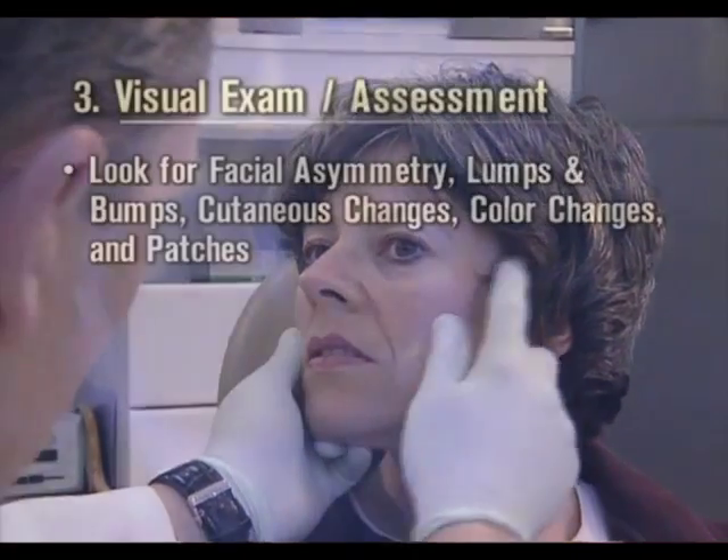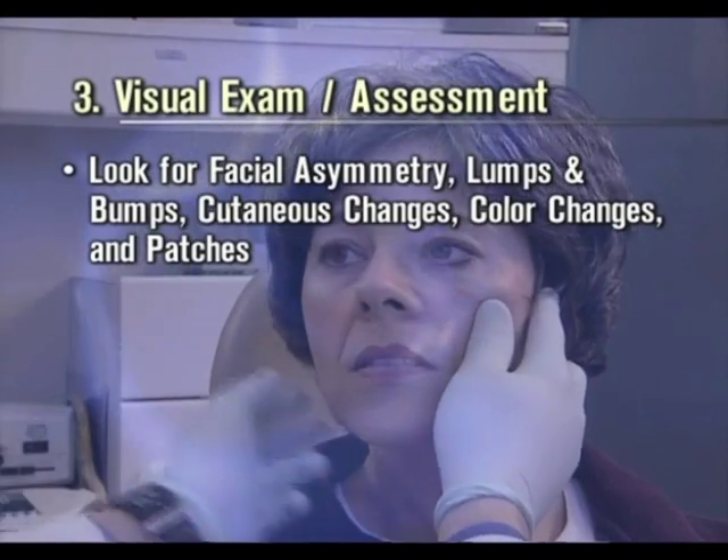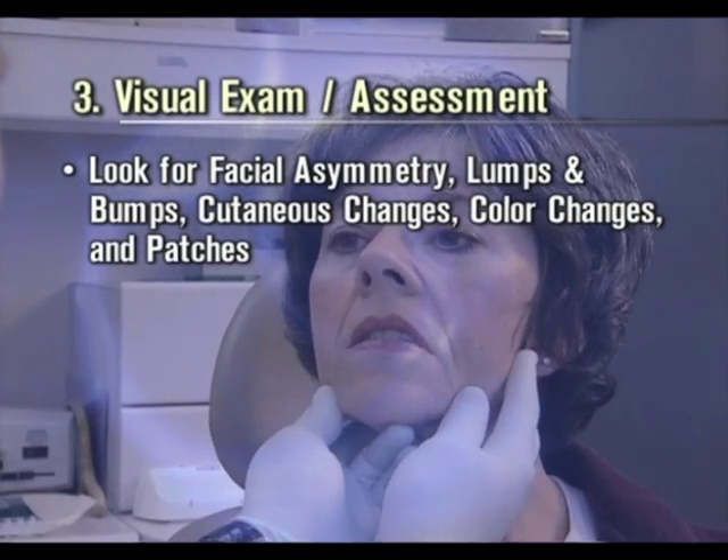Do a visual exam and assessment of the face, head and neck. Look for facial asymmetry, lumps and bumps, cutaneous changes, color changes and patches.